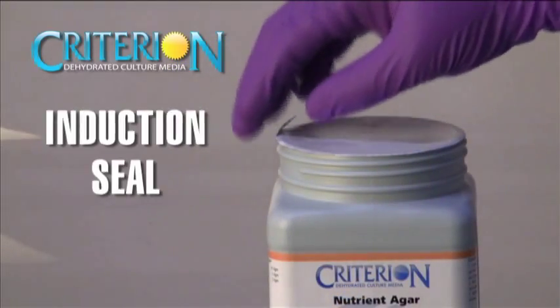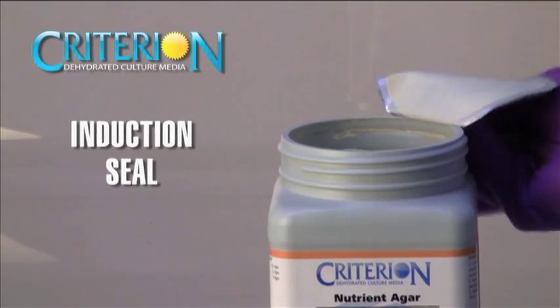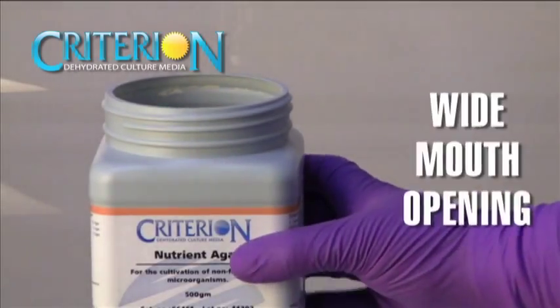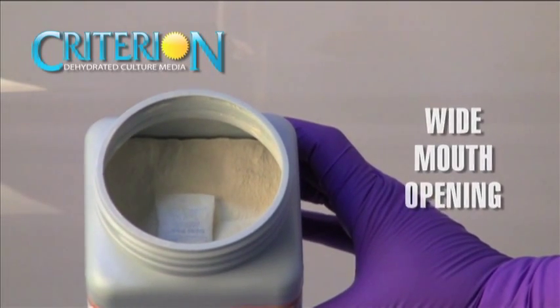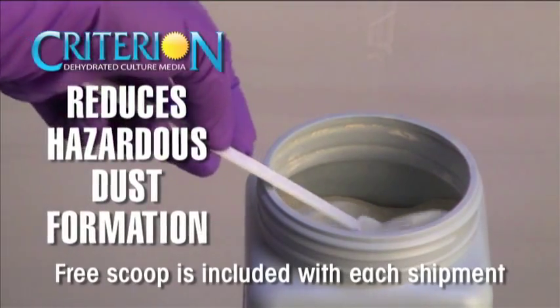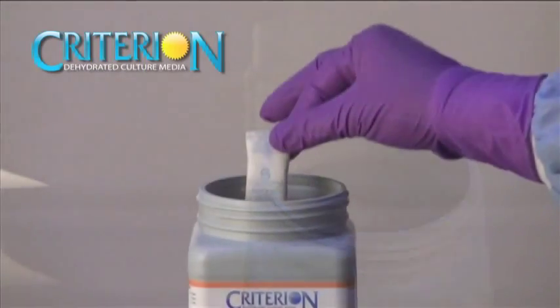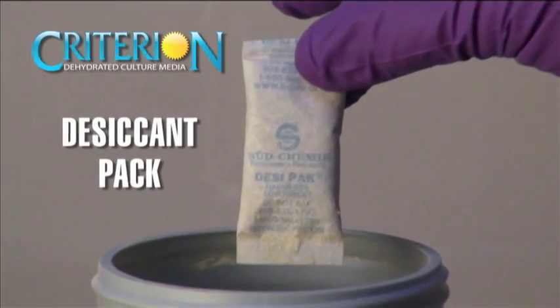A pull-off induction seal prevents moisture from clumping the media, keeping it fresh and dry. The extra wide opening allows for easy access to use a scoop when measuring the powder. It also reduces hazardous dust formation, preventing inhalation hazards. A silica gel-packed desiccant is included in each jar to prevent clumping.